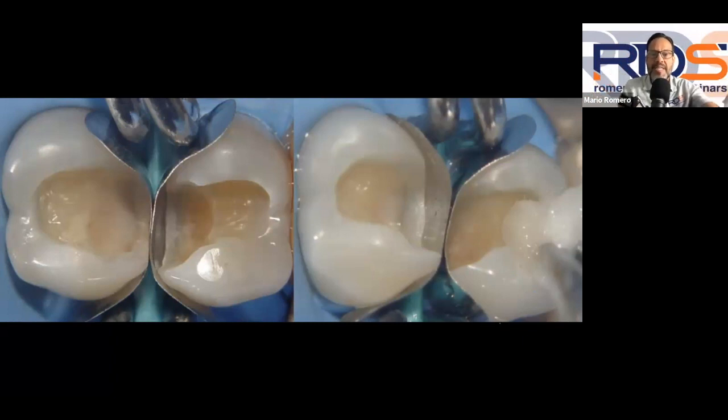And not only that, but as you can see, they are placed towards the mesial or the distal of the actual wedge. So the wedge is not only stabilized by the ring, but also the ring sits on the wedge and on the tooth surface, so that it is completely stabilized. As you can see, you create a really good anatomy of the bands. You have a really good lingual embrasure created by the pressure given by these two rings. You have a very nice buccal embrasure created by the pressure of these two rings. And you have a beautiful flow of your sectional matrices that are actually following the contours of the tooth.